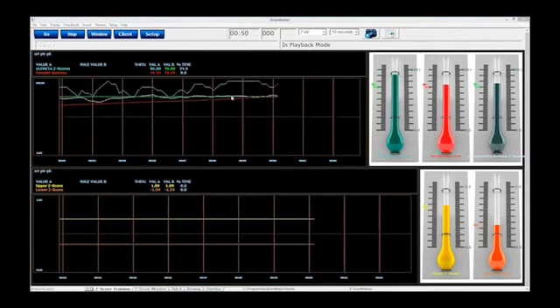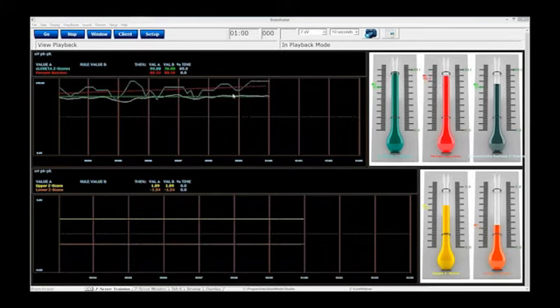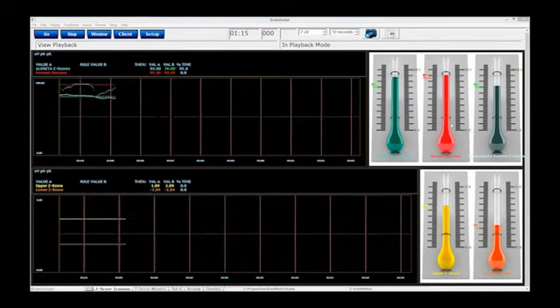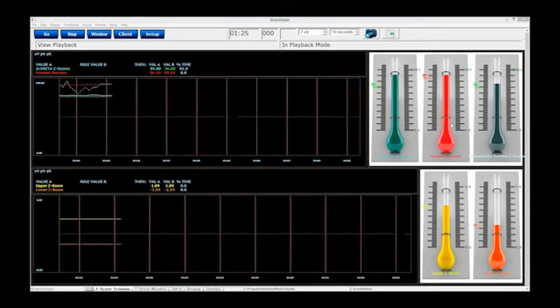That is now the way that this protocol is kind of working right now. It's basically saying when both are successful, you're going to get a reward, and that's where this percent success is coming into. Both are successful. It's going up. The way I've designed this protocol right now, and I'm going to play around with it, that's why I'm saying it's not available right now, is I have a dual MIDI reward on it. When one of them is above, you get one sound, basically an organ that goes as a sustained level. When both are successful, you're going to hear a louder organ at a higher tone that's going to basically tell you, okay, they're both being rewarded.